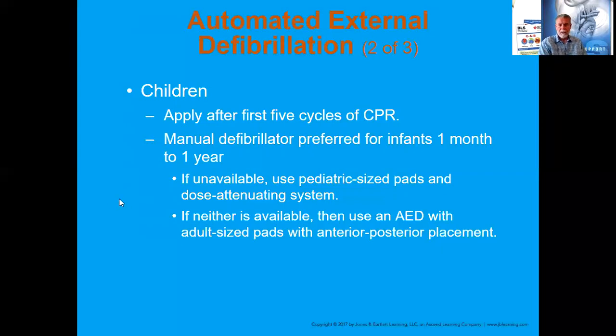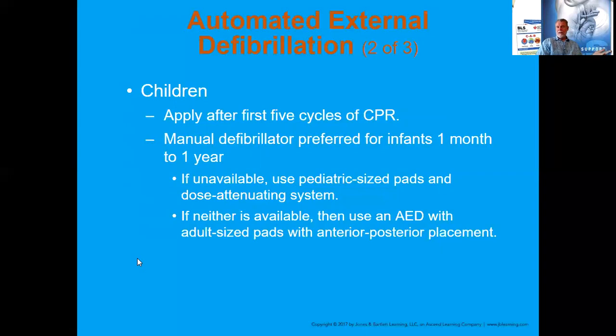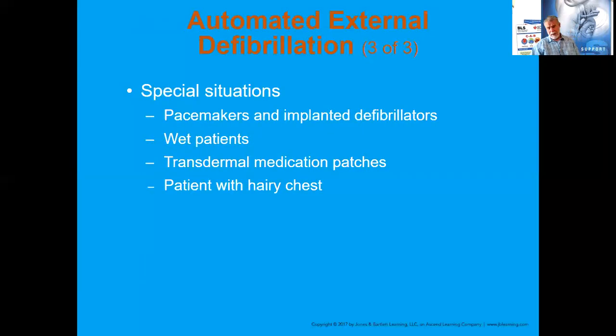Here's where they say at the very last part, if neither is available, then use the AED with adult pads on the front and back, anterior, posterior, right? That kind of takes you back to medical terminology, but that's why that chapter is so important, because these terms start being put into your readings, and there's the expectation that you know what those are. So anterior, posterior means just the front and back.